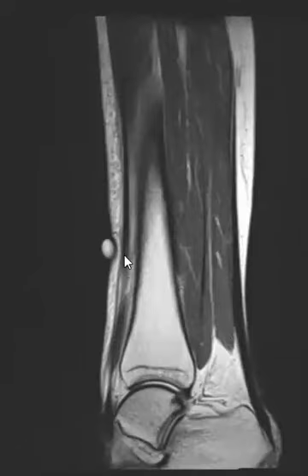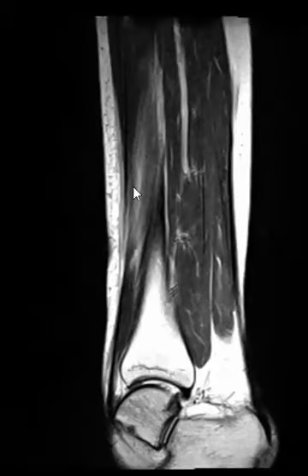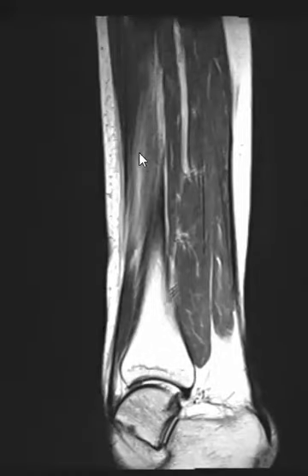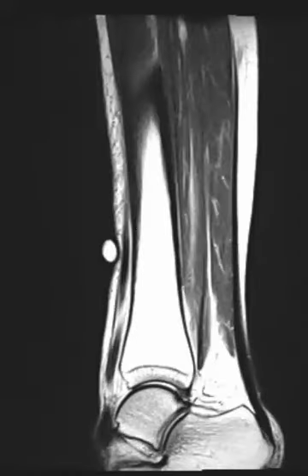It's right over that. The tendon looks normal, but the muscle, if we window this properly, is a little bit bright, so a little bit of edema within the muscle. This may be some myositis or muscle strain from overuse, but the tendon itself looks good.